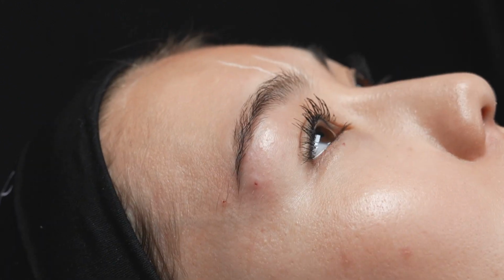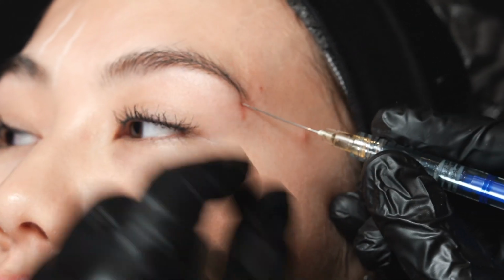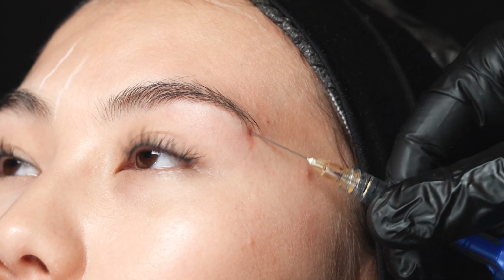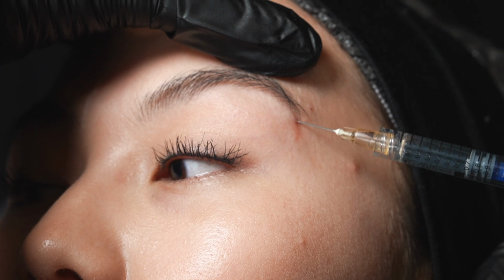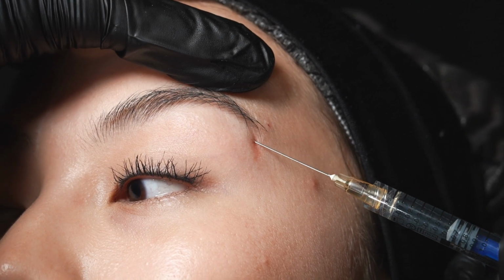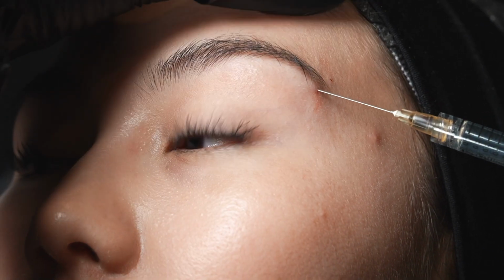Да, давайте я сделаю в другую сторону, закончу. Да, но мы видим прекрасный эффект на пациентке. Спасибо вам большое. Итак, беру, фиксирую недоминирующей рукой. Слышали клик? И захожу глубоко в ткань. Смотрите, если я попробую подвигать канюлю, то я абсолютно не вижу ее, она не визуализируется. Затем я немножко растягиваю область брови и ввожу под бровью, чтобы достичь элевационного эффекта, чтобы у меня приподнялась бровь. Но это на самом деле не распространенная техника.